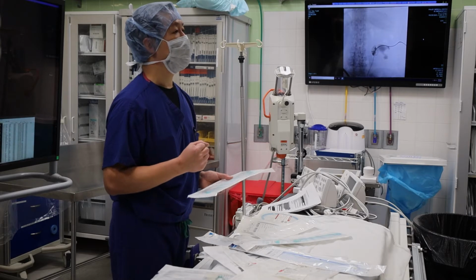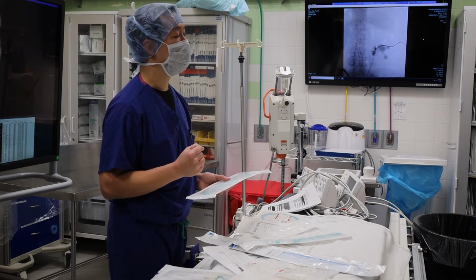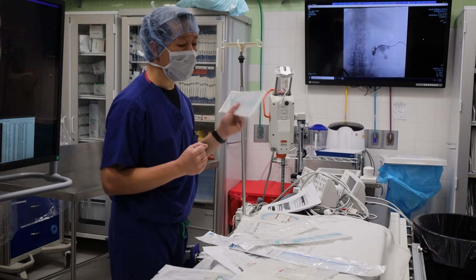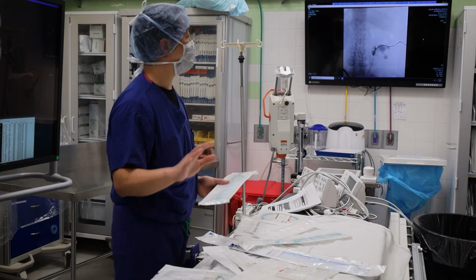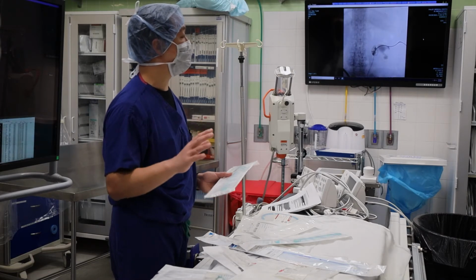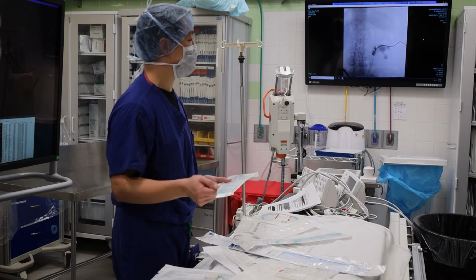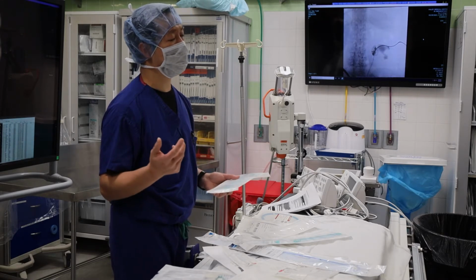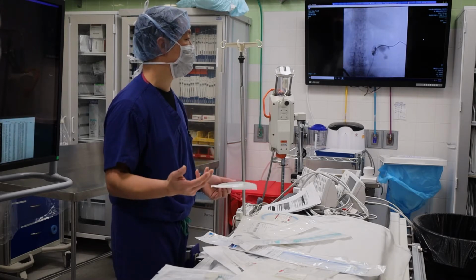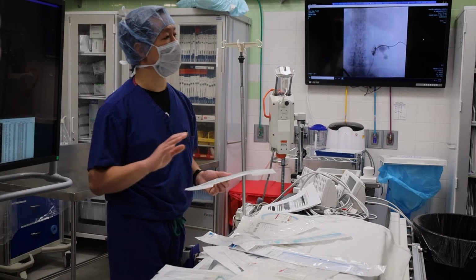Why do you need a 3-way stopcock or a 2-way stopcock? So you can flush if it gets obstructed. Okay, really, if you're putting it in for clean urine, you do not need to flush. Because when you flush, sometimes patients at home accidentally turn it off and now it's obstructed. Or they flush themselves and they're not sterile and they give themselves an infection. So if it's straightforward, simple urine, sometimes you don't need a 3-way.